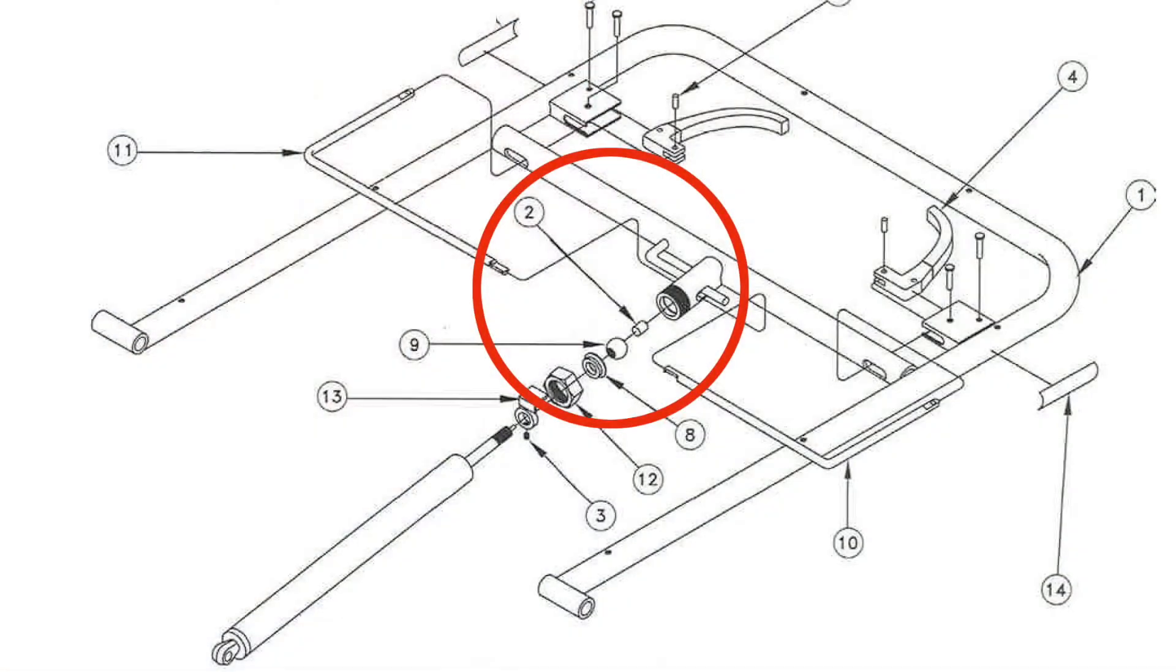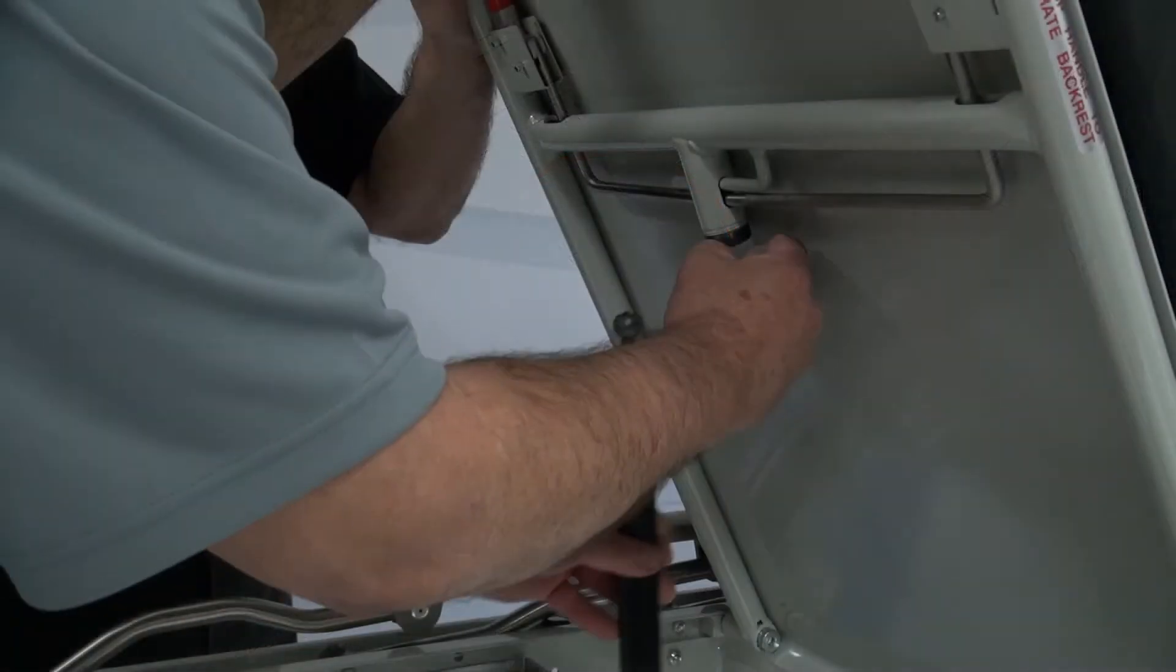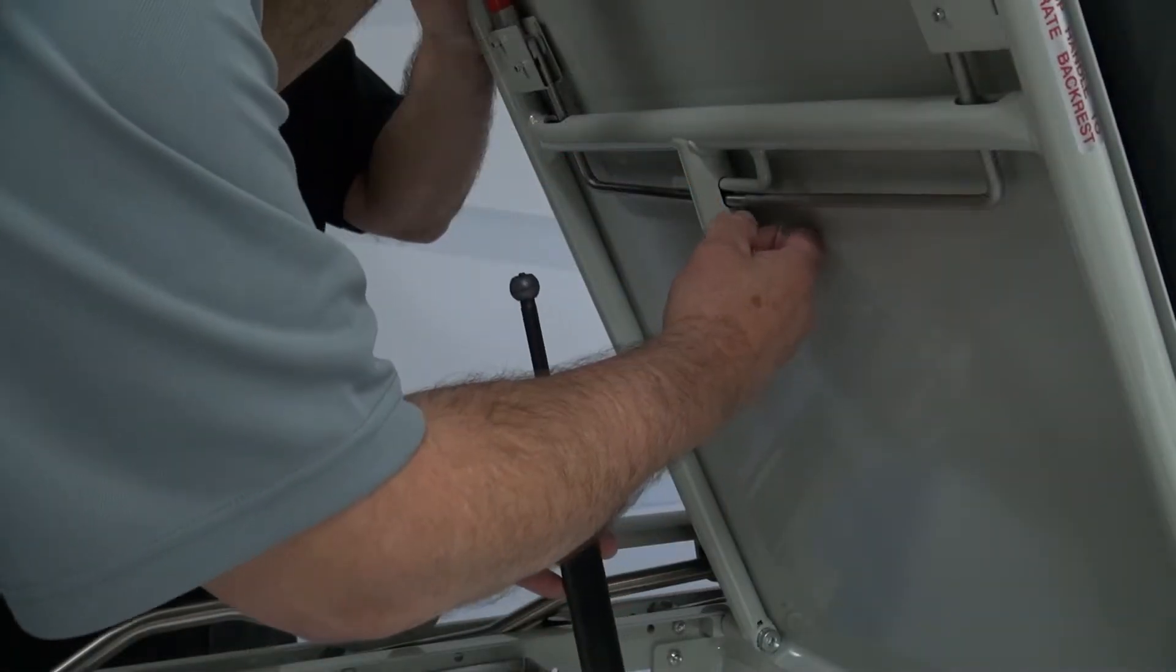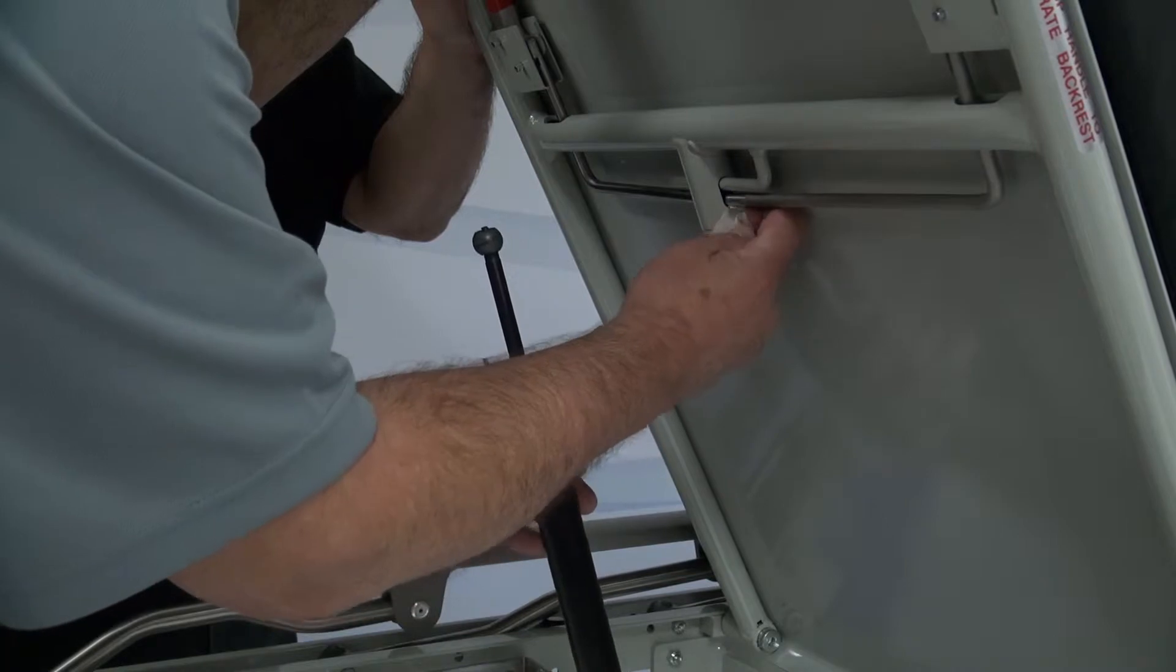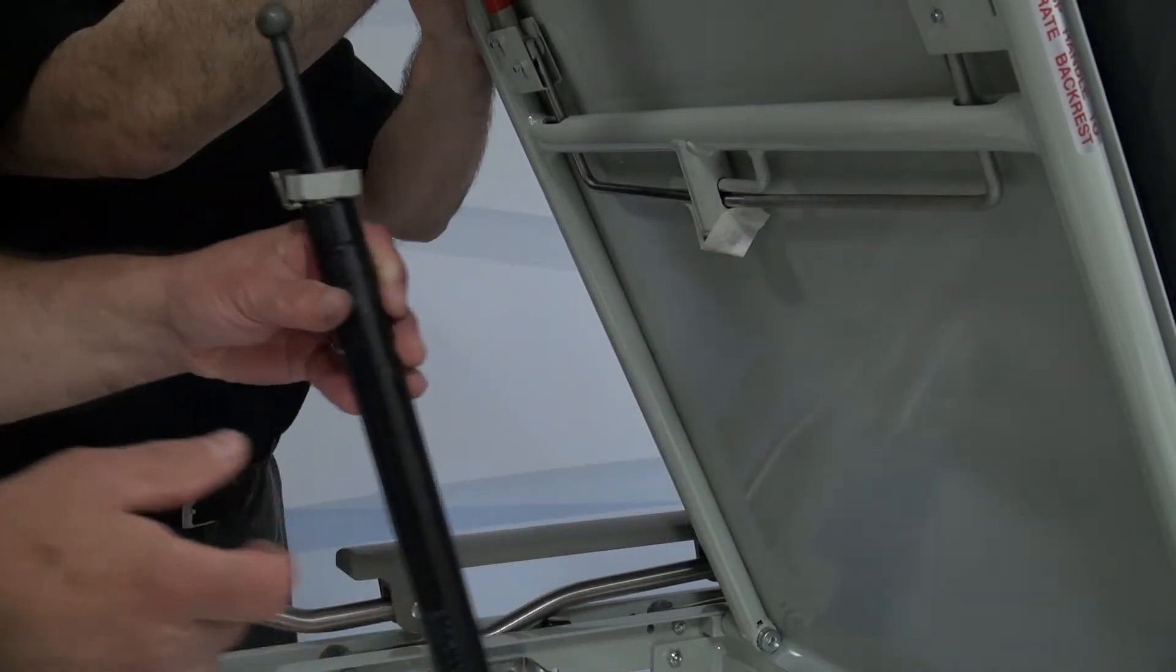Make sure the actuating pin, number two on the diagram, does not fall out. You can apply a piece of tape on the threads of the tube to secure it in place.